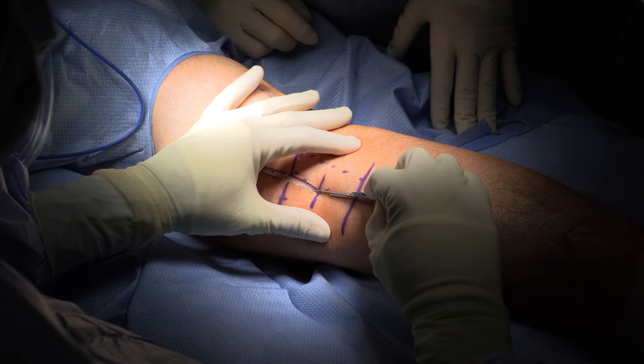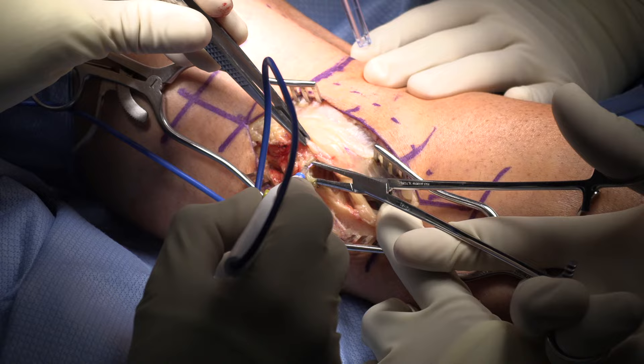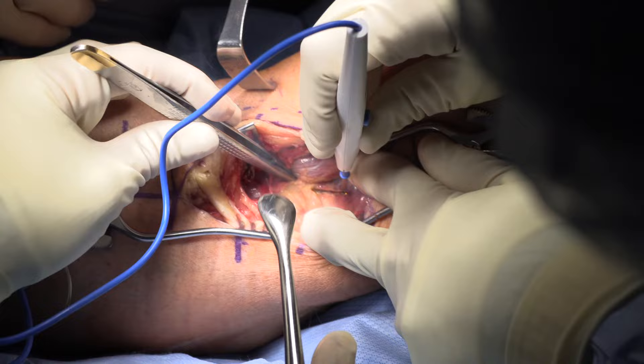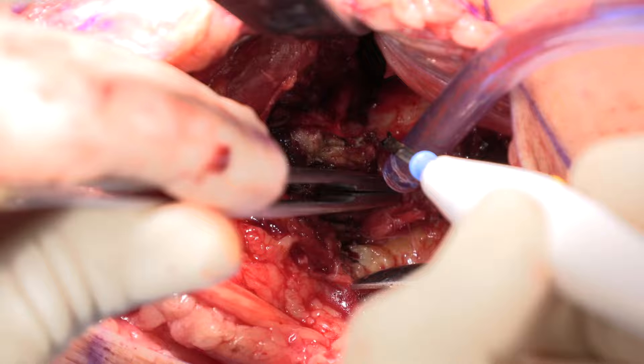A longitudinal incision is made in the posterior medial aspect of the knee. Dissection is carried down through the fascial plane until the fascia is exposed and then excised, revealing the semitendinosus and the medial head of the gastrocnemius. The semitendinosus tendon is retracted medially while the medial head of the gastrocnemius is retracted laterally. The periosteum is then incised, revealing the fracture. The fracture edges are cleaned and exposed, any fracture hematoma is removed, and a blunt Hohmann retractor is placed under the gastrocnemius to allow for further exposure of the fracture.